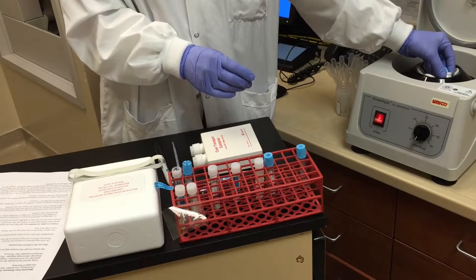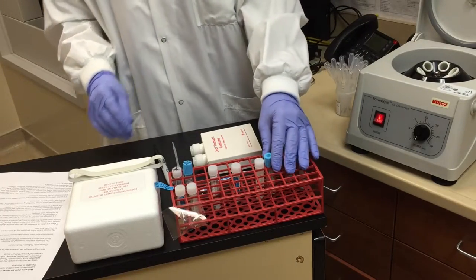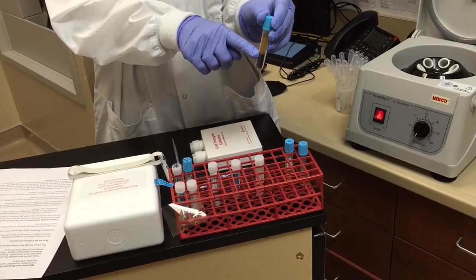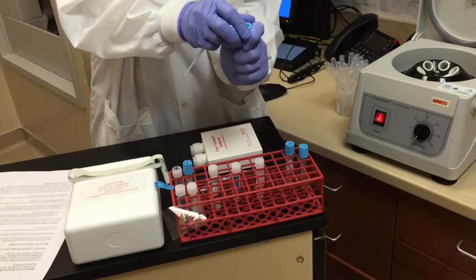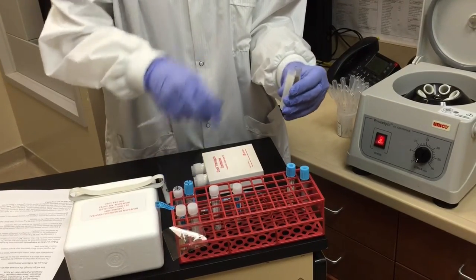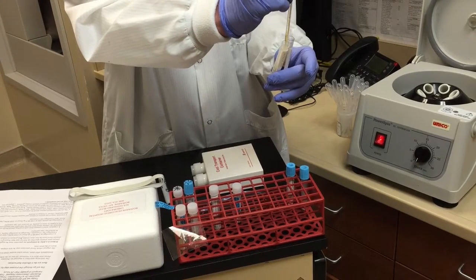We will be spinning for 15 minutes and then carefully remove the plasma from the tube, being careful to avoid the buffy coat, which is the layer of cells between the plasma and the red cell layer. You're going to use a transfer pipette to transfer the plasma into the plastic aliquot tube.